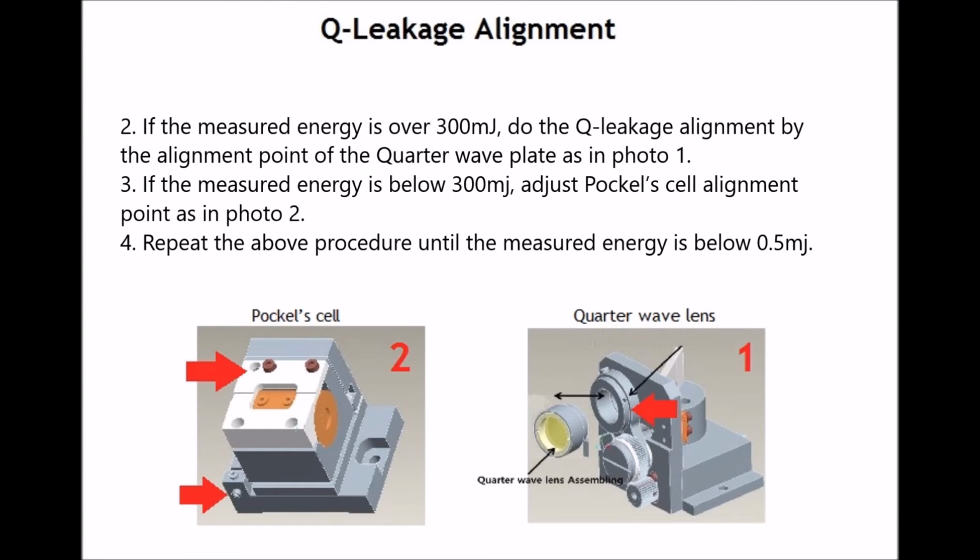2. If the measured energy is over 300 millijoule, do the Q-leakage alignment by the alignment point of the quarter wave plate as in photo 1. 3. If the measured energy is below 300 millijoule, adjust Pockels cells alignment point as in photo 2. 4. Repeat the above procedure until the measured energy is below half millijoule.